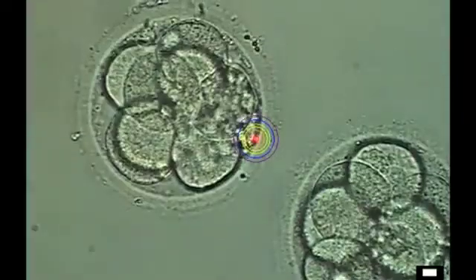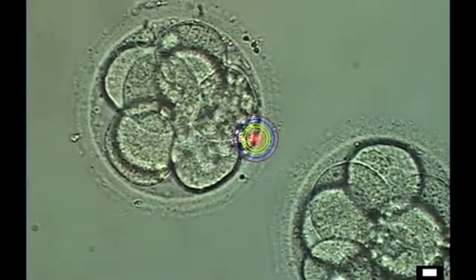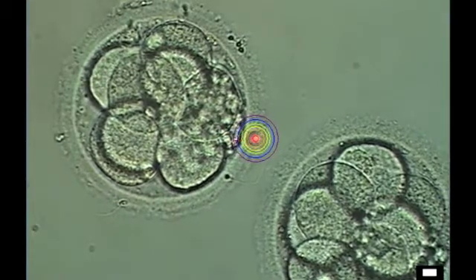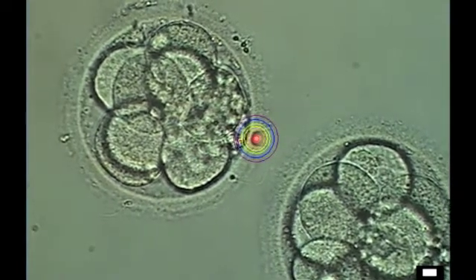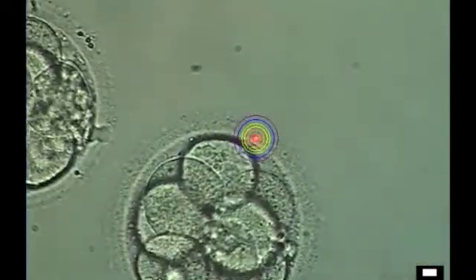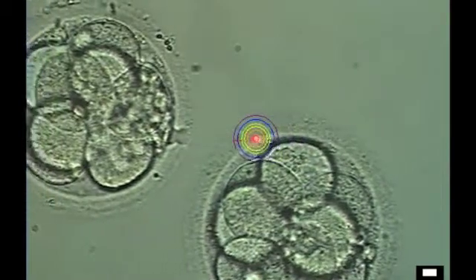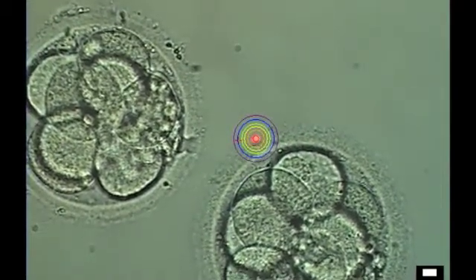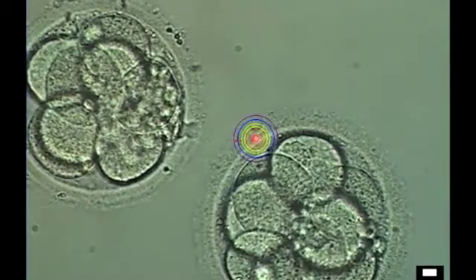By the third day of development in vitro, human embryos are about eight cells. This video shows a technique called assisted hatching. It's done using a non-contact microoperative laser. The circular pattern that you see is actually the target area where the laser is being used.